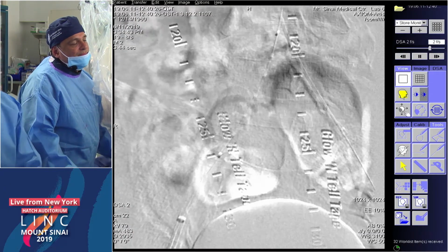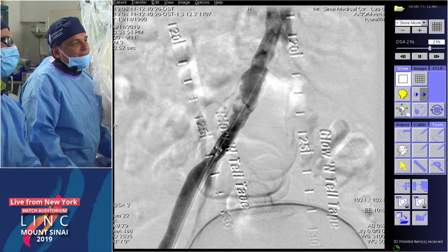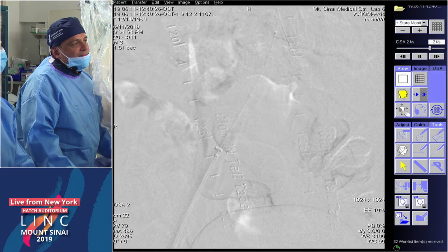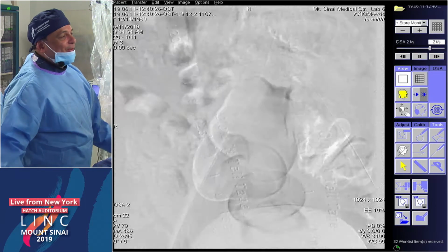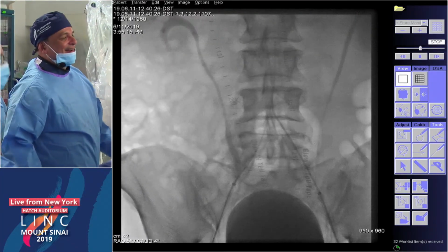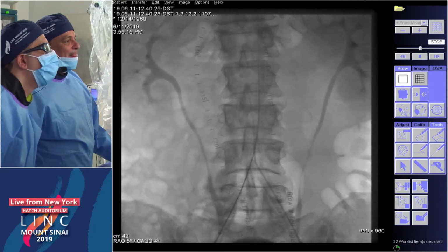If this were my case in my hands, I'd feel like I could very accurately land a balloon expandable covered stent. In your hands, I'm not as sure. So. I totally agree, Jim. No, PK. All kidding aside, PK and I go at each other all the time here. But no, I think a covered stent's still the way to go.